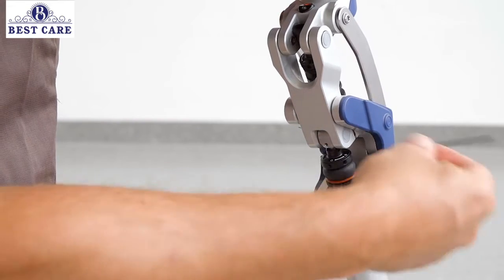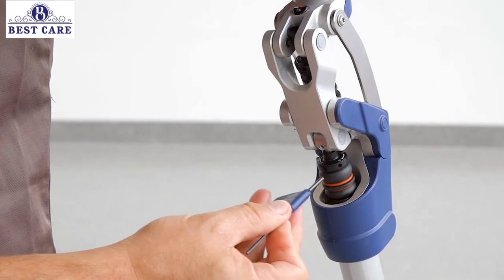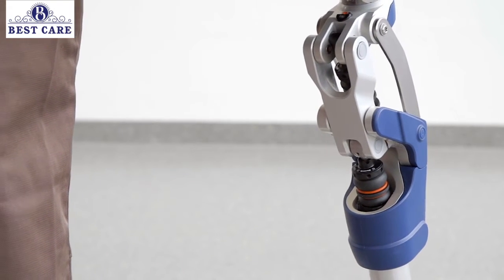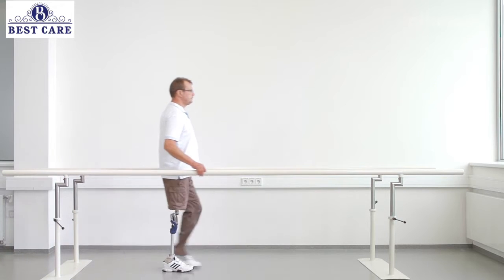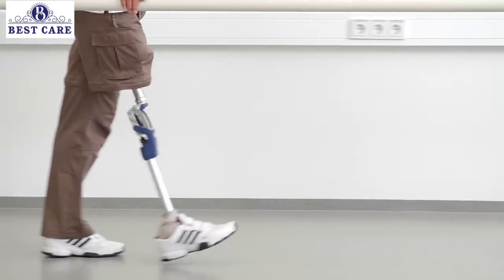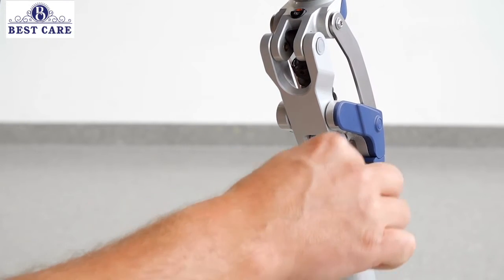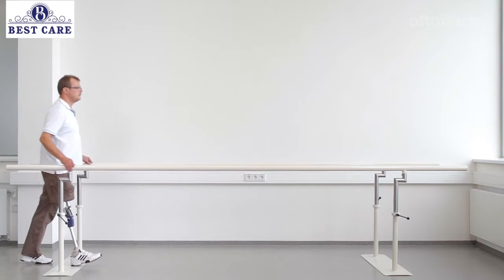At this point, the EBS unit has too much pretension, which leads to no stance phase flexion. The user will have difficulty moving through stance phase since the prosthetic foot is relatively far in front. Please decompress the EBS unit a bit so that the user experiences a more comfortable heel strike and can walk with more comfortable stance phase flexion.